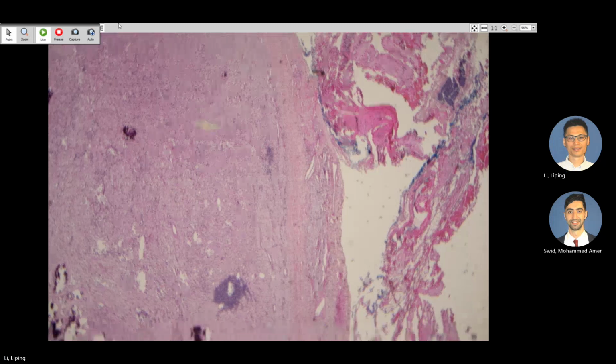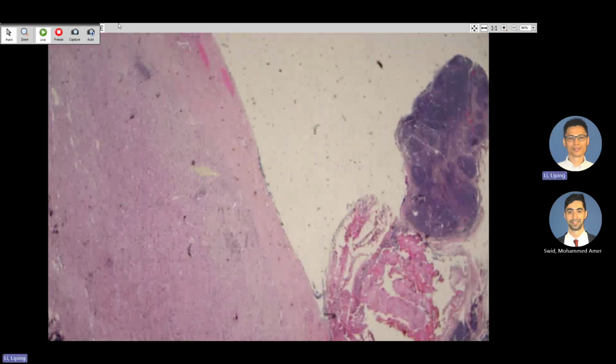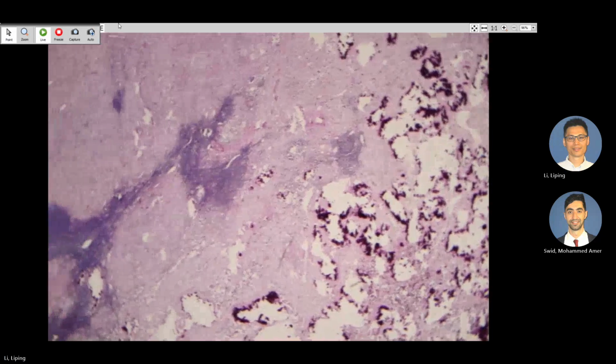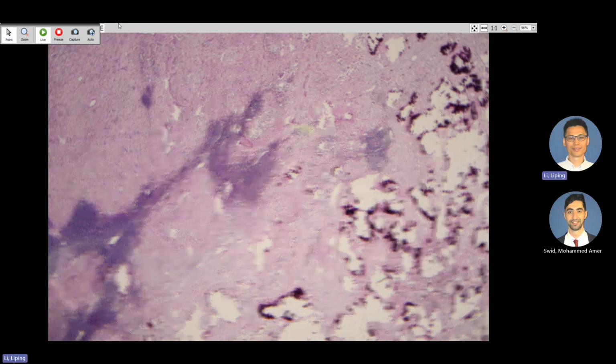Tricky here. This one: lymphocyte, Schwannian stroma, ganglion cell. We have all parts to make a diagnosis. But don't stop, just continue to scan. Lymphocytes. Ganglion cells, lymphocytes. But we can see some cells like this. Let's go to high power.